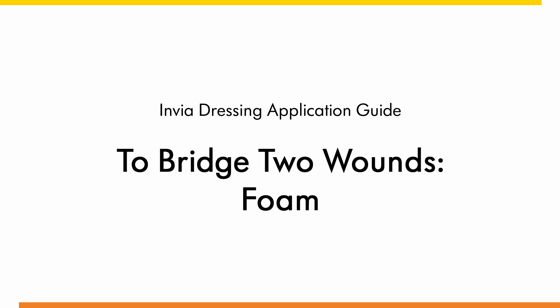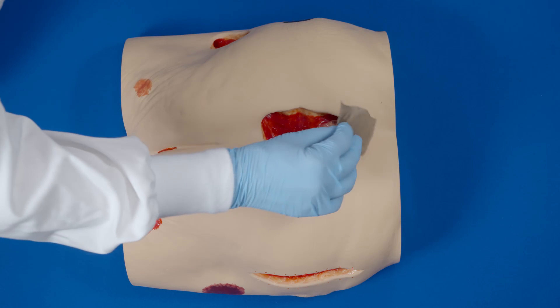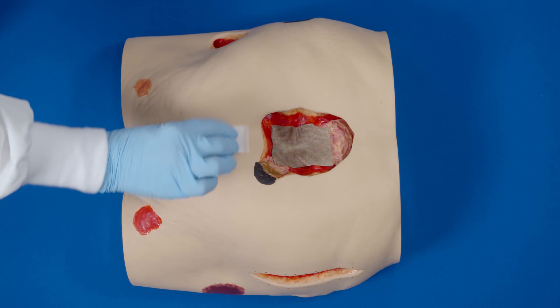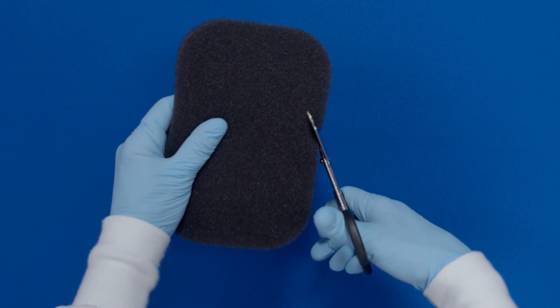Dressing application guide for bridging two wounds. Thoroughly clean the wound. If required, apply a non-adherent contact layer over bone, tendon, or other sensitive structures. Apply skin prep to protect the peri-wound skin.